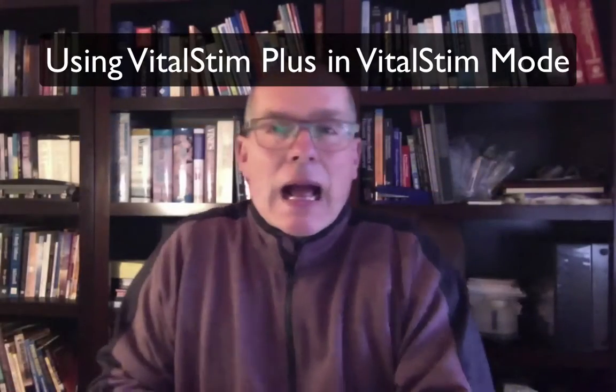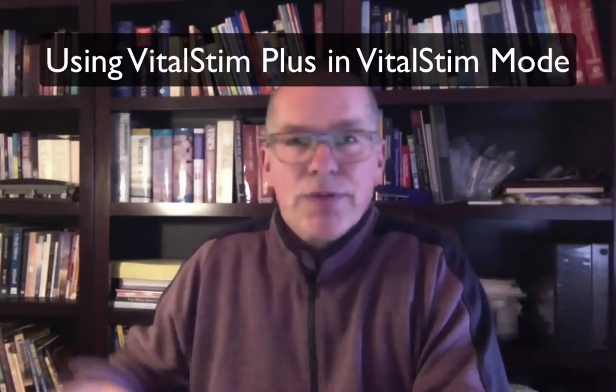Hello, I'm going to show you how to use VitalStim therapy on the new VitalStim device called the VitalStim Plus. The VitalStim Plus came out this year, 2016, and it offers the user a variety of options that are not available in the small handheld device which I have right here.